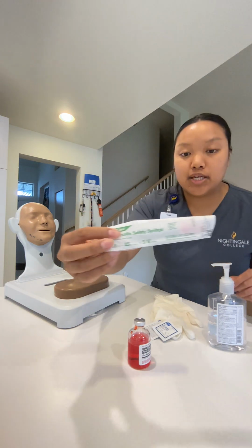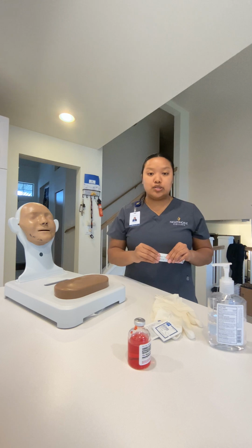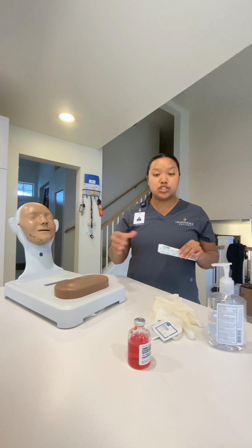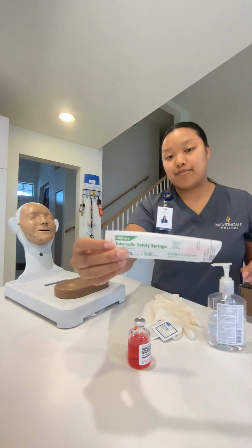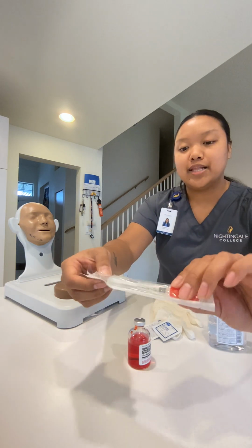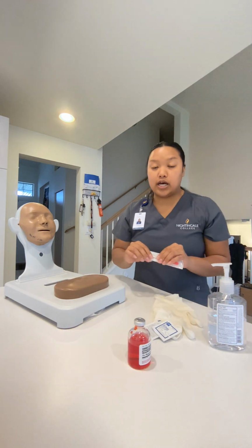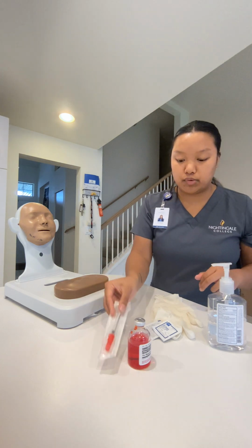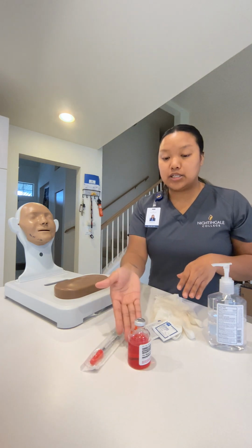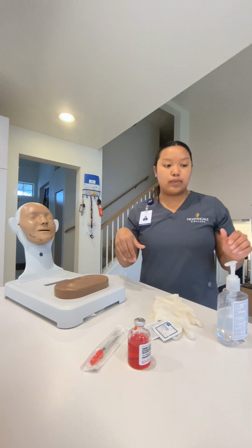I have my needle here that I'll be using. For subcutaneous injections, you want to use a 25 to 27 gauge and a 3/8 to 5/8 inch needle, but this is what we have in our kit, so this is what I'll be using. This is 1 milliliter. I wanted to make sure that I didn't get a syringe that was too big or too small for the injection. I have all my other supplies here: my heparin vial, my hand sanitizer, my gloves, and my patient.